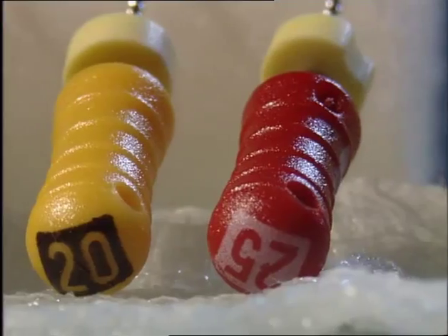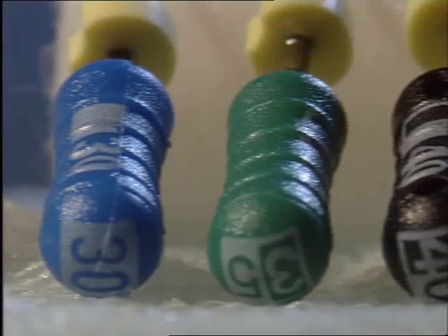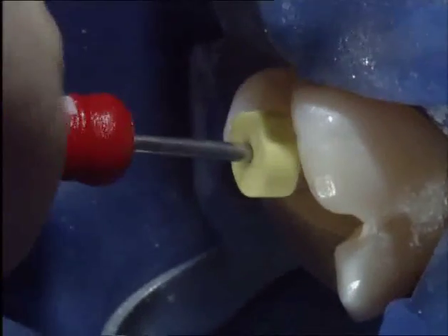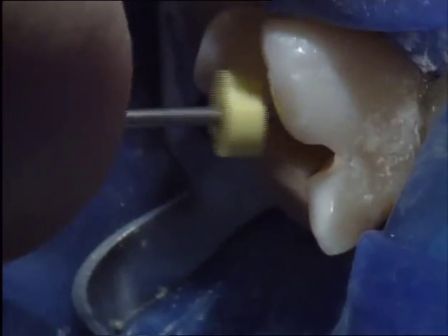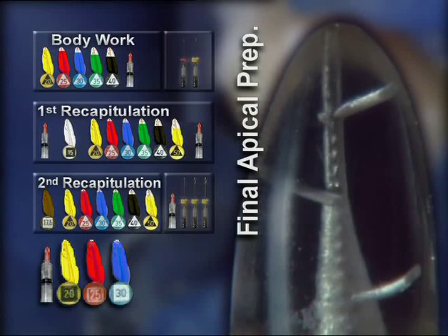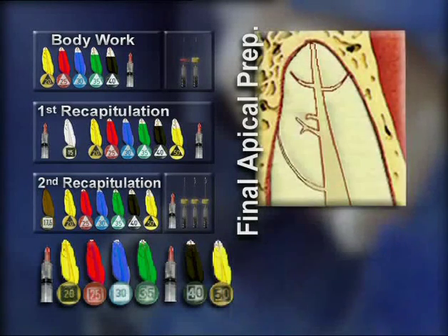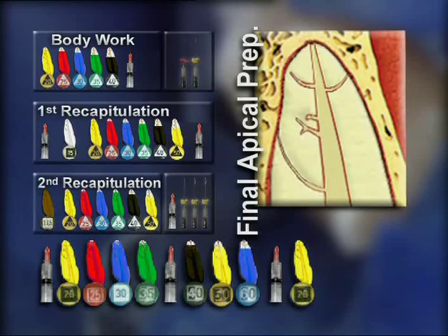The final apical shaping is done in a serial step-back preparation. Serial step-back preparation entails the use of a series of progressively larger instruments that are worked or stepped back successively further from the end of the root canal preparation. Apical portions of canals are best manipulated with files. They are used with short in and out strokes in the long axis of the pre-curved instrument. Files are worked in a gentle motion, only to a depth where they are slipping and sliding passively. The multiple waves of delicate shaping finally lead to an extremely smooth tapering preparation.